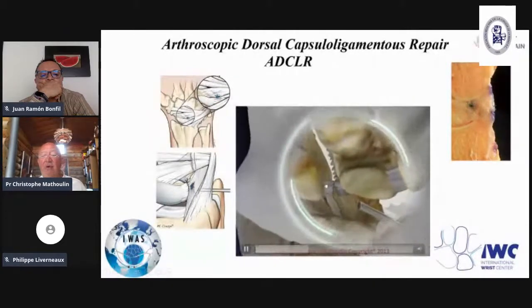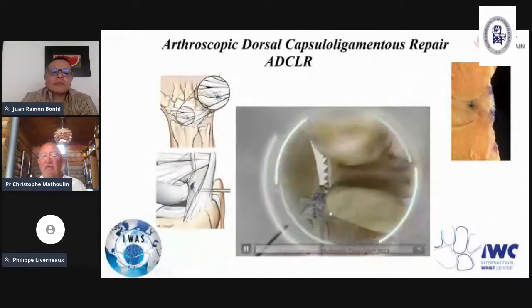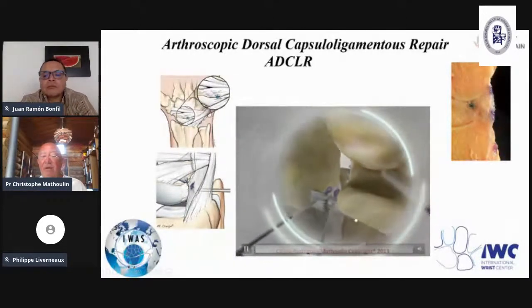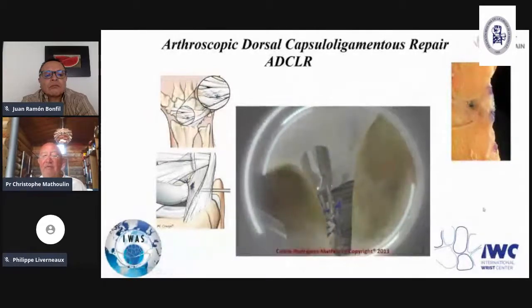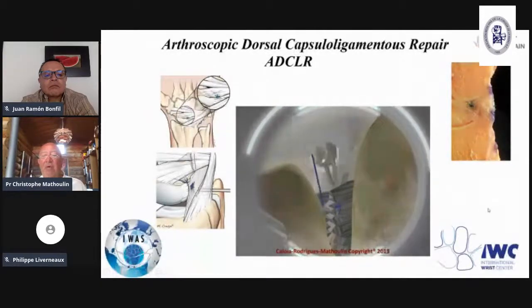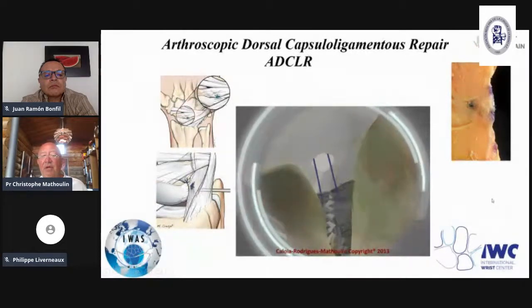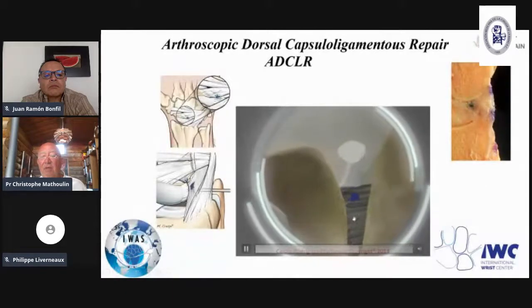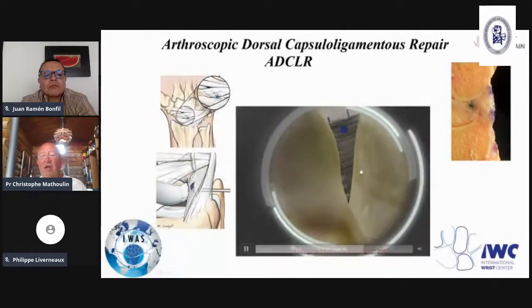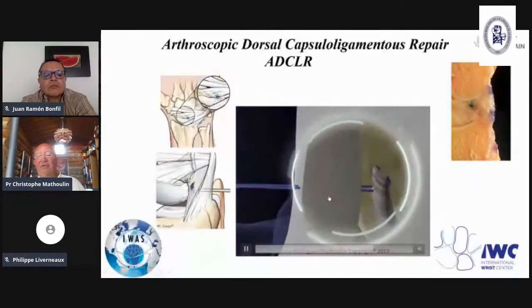You need, of course, to have a part of ligament attached to the scaphoid for this particular technique. You enter in the mid-carpal. You retrieve the two sutures and put them outside. You perform the knot outside between the two sutures. You pull down, and the knot is going to be placed in front of the ligament. And after that, you just restore the anatomy.